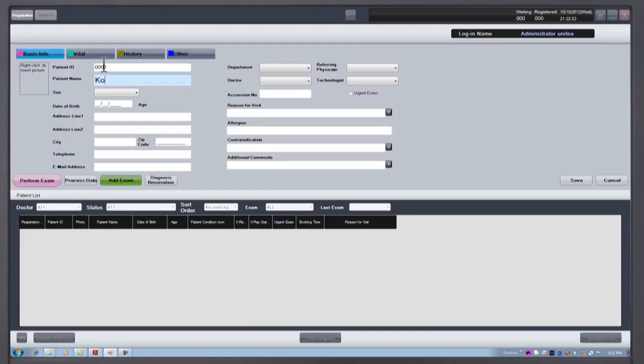Patient Registration: Patients can be registered manually from any computer in the office, or automatically.